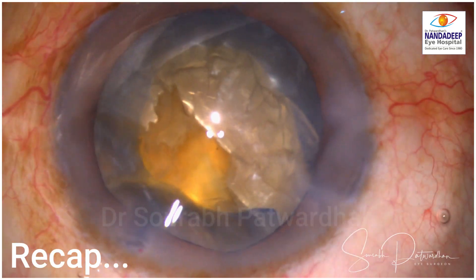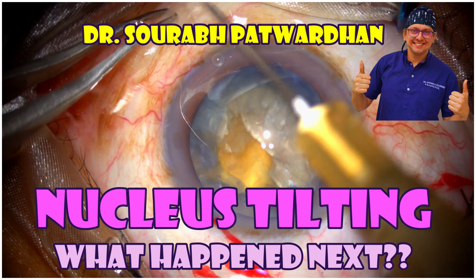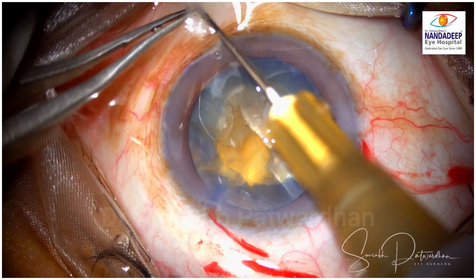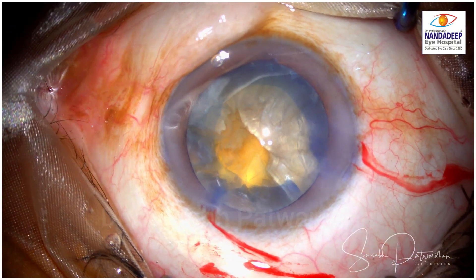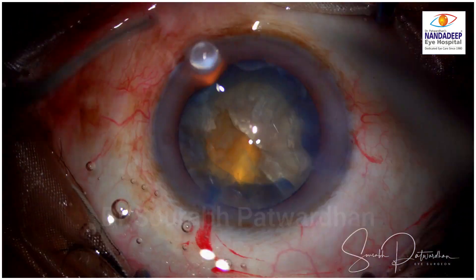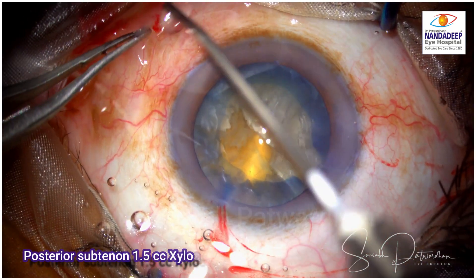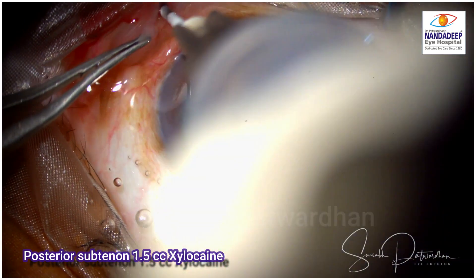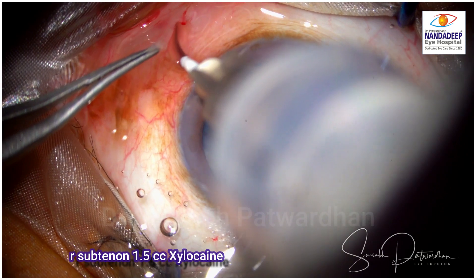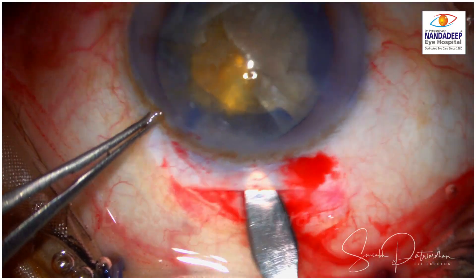Now I am sure you are curious to know what happened next. So I shifted to sub-tenon anesthesia. First, I give a little bit of subconjunctival xylocaine in the infranasal area so that it makes the sub-tenon anesthesia technique — which is with a blunt 18 gauge cannula — very painless for the patient. There is little bit of discomfort while injecting, but otherwise the patient is quite comfortable. Wait for a minute or two for the anesthesia to take effect.